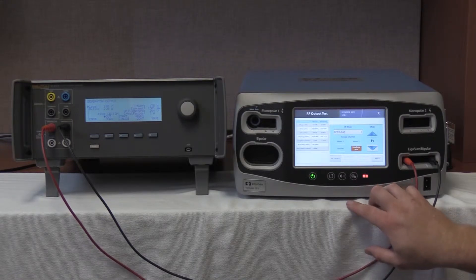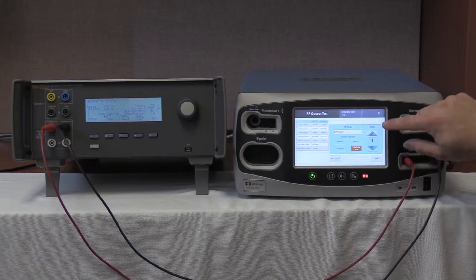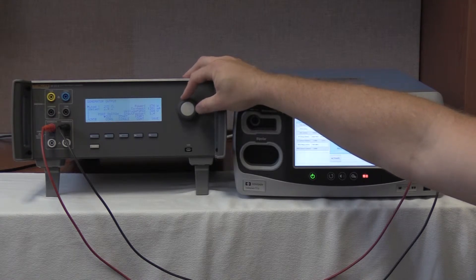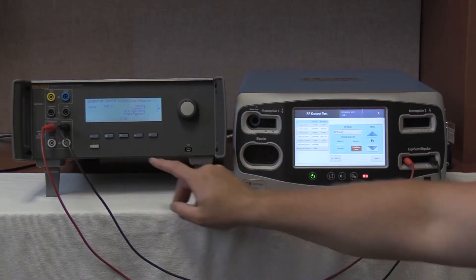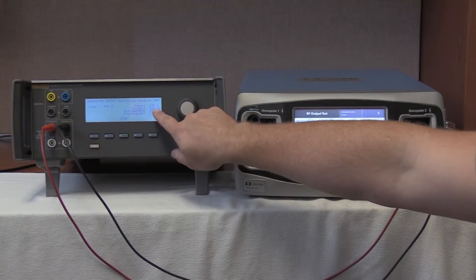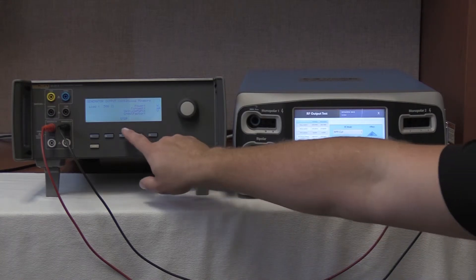We are now going to select bipolar resection cut by pushing the mode button and going up one to BPR cut. We are going to select Effect 6 again, and on the QES3 we are going to select a 500 ohm load by rolling the knob up to 500 ohms. Once 500 ohms is selected, start continuous on the QES3 and activate on the FT10. We are looking for 547 to 735 milliamps. We are reading 624 milliamps on the QES3 with an output of 629.2 milliamps on the FT10. Deactivate and hold values. Stop on the QES3.